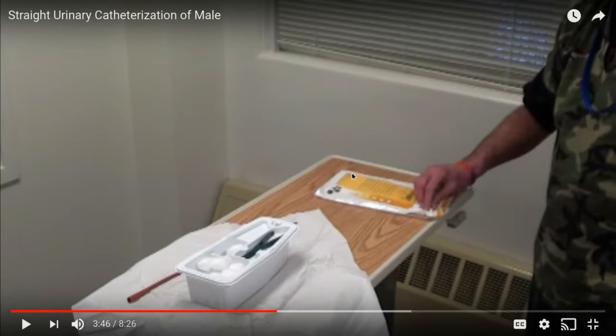One more thing I want to say. As you can see, he has got his badge in his pocket. He has done that so that the badge does not fall in his sterile field. We would do the same thing with long hair or anything that could dangle down into that sterile field. We would keep it pulled up, pulled away, tucked away, removed, so that it doesn't get in the sterile field. If you have a loose watch, anything that could get into that area, you would remove.